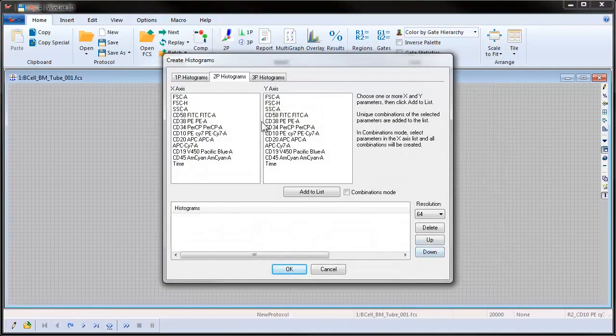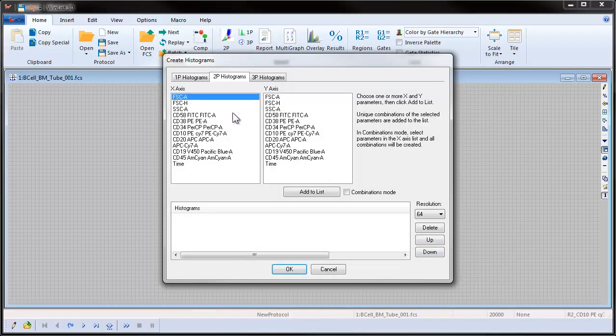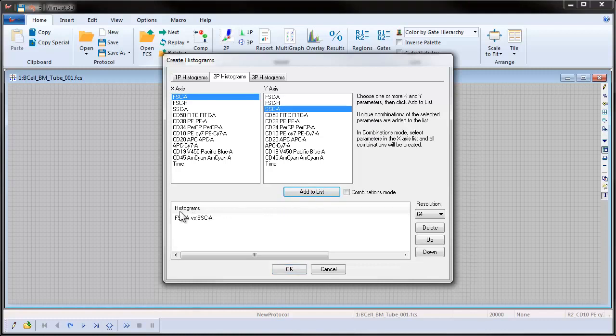In the Create Histograms dialog, select Forward Scatter and Side Scatter and click Add to List. The histogram will be added to the list to be created.